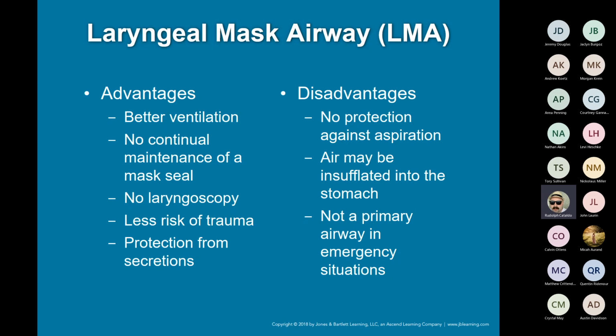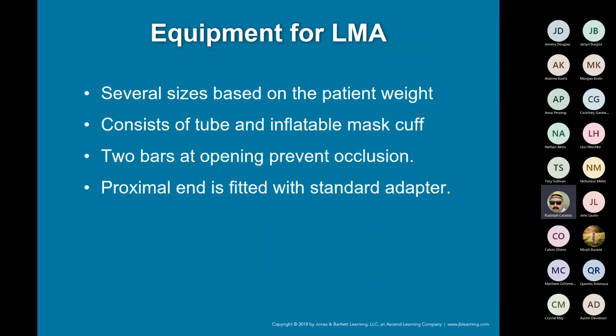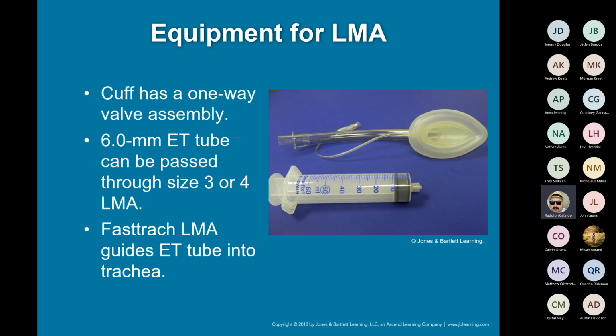Where we see LMAs primarily used now, I'd say, is during surgeries, same day surgeries. They use LMAs a lot, but again, that's in a clinical setting where they have a lot more stability of the patients. They're not concerned about airway management because they can manage the airway pretty quickly if things go south.